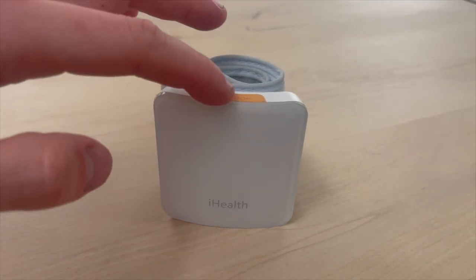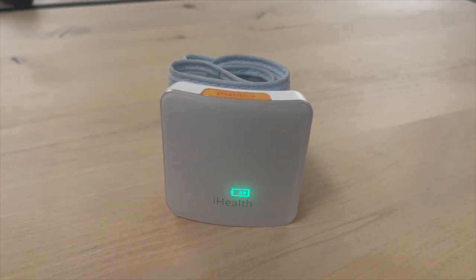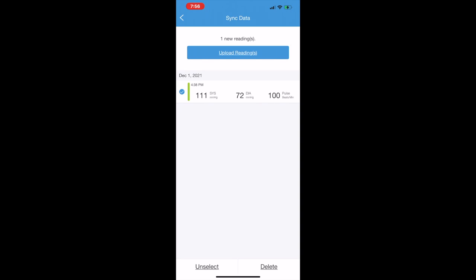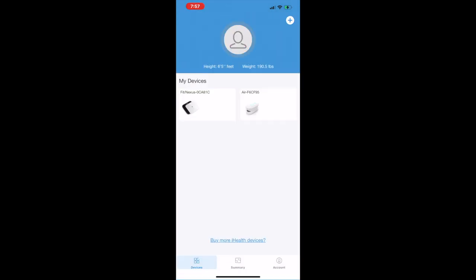You can then sync your data with iHealth by opening iHealth My Vitals Pro, selecting your blood pressure monitor, and then holding the start-stop button for 2 seconds to activate Bluetooth. You can then upload your readings and sync your data.